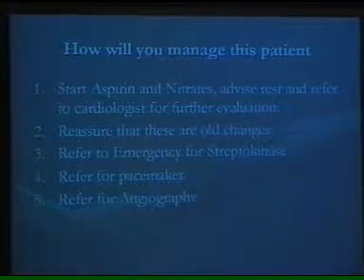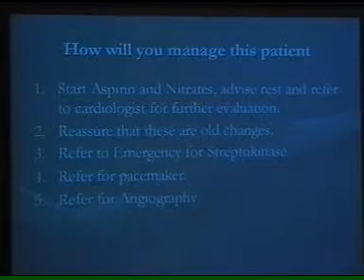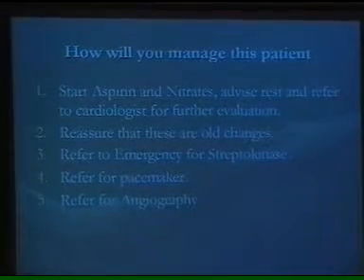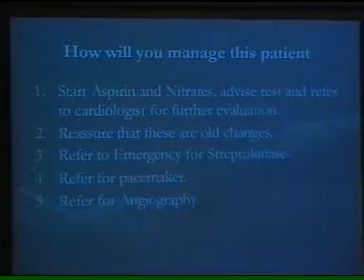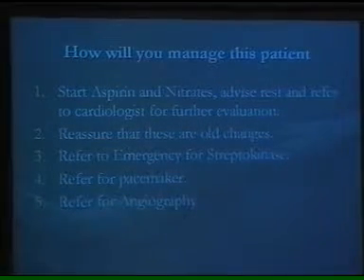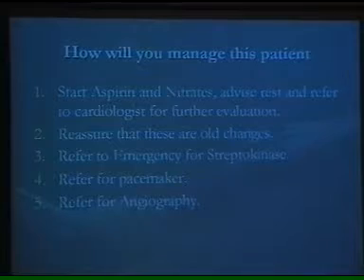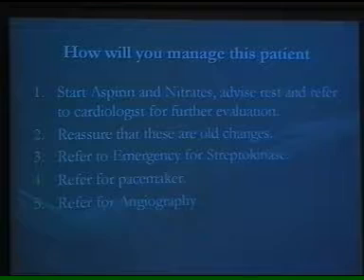They can make some tricky options like: start aspirin and nitrates, advise rest and refer to a cardiologist for further evaluation, because you may be thinking that you may need an echo or thallium or anything. Reassure that these are old changes is one possibility. Refer to emergency for streptokinase: those who think there is acute MI may refer the patient for streptokinase. For pacemaker: those who are not familiar with the rhythm part of ECG. Direct for angiography: those who are not aware of the non-invasive options.